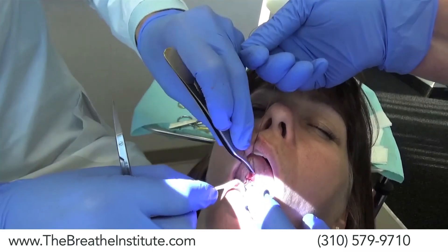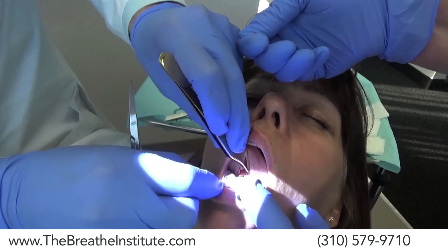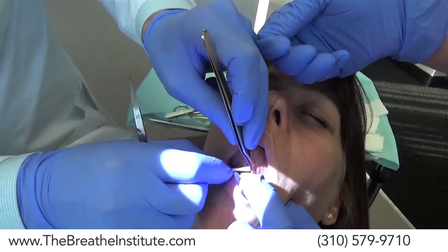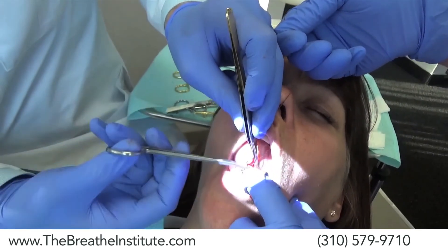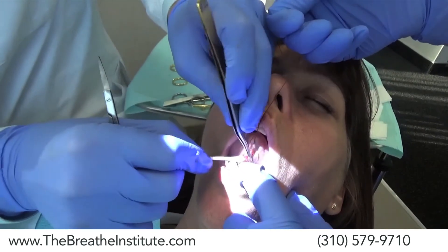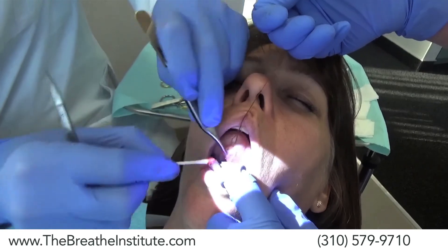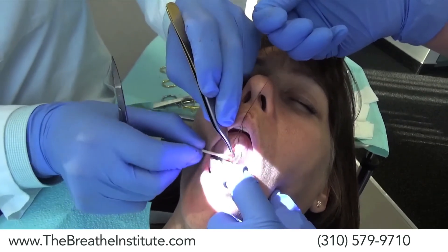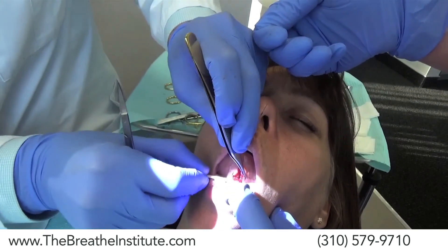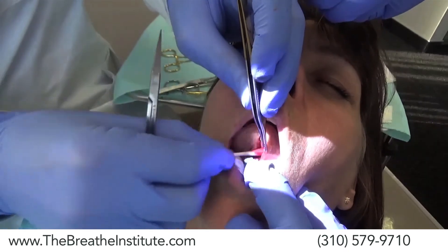Not only does the q-tip clean the area so he can see what he's doing, but it is releasing a lot of the fascia so that he can make fewer cuts and cause less trauma to the tongue. He's pushing the blood vessel down so he doesn't get into it — you can see the blood vessel going down and the fascia band there.